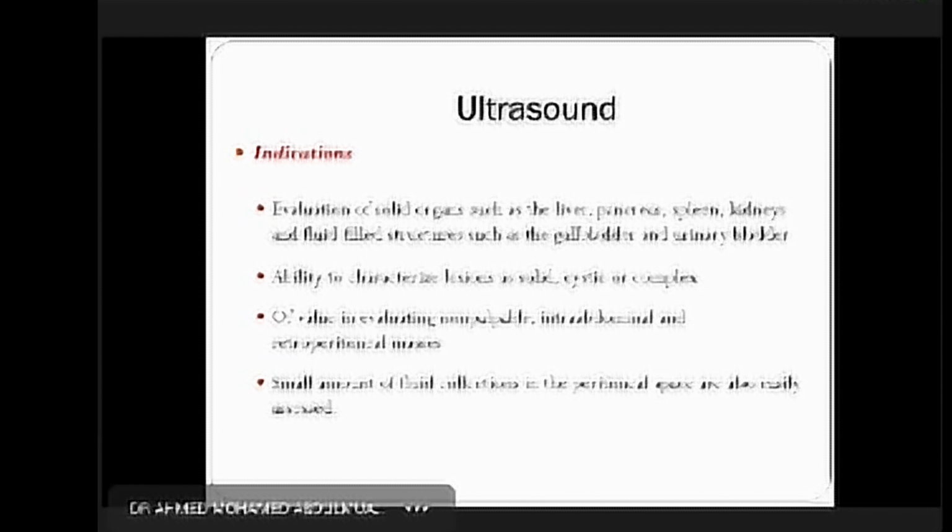So the patient should be fasting a minimum of 6 hours. Fasting is a must, because if the patient is not fasting, the gallbladder will be collapsed. So you cannot assess the gallbladder for any stones or cholecystitis; it cannot be seen. That's why whenever you have an abdominal or hepatobiliary system ultrasound, your patient should be fasting.